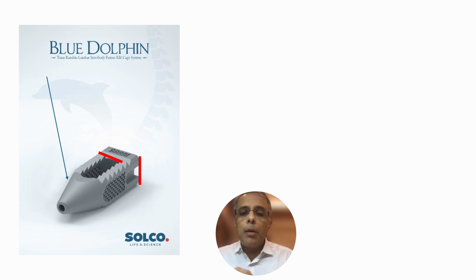Now, if we talk about height and width, the width is fixed at 9.5 so that when the cage is inserted into the Trans-Kambin zone, it is always inserted with a 9.5 millimeter width in the superior and inferior space, and then it is rotated to its height so that the end plates are flush with the serrations and the graft.